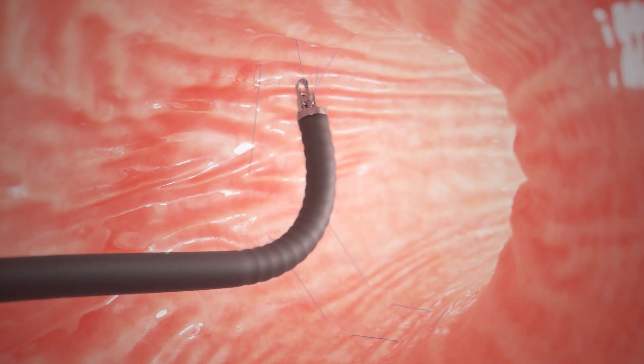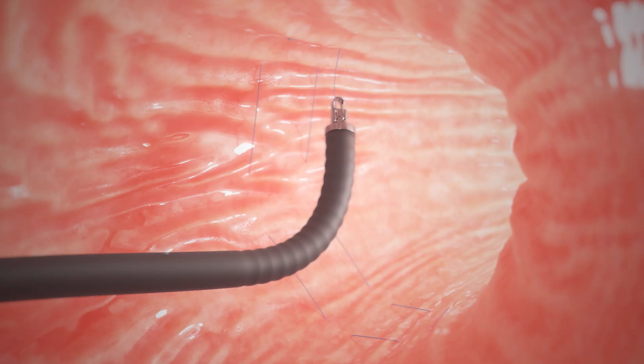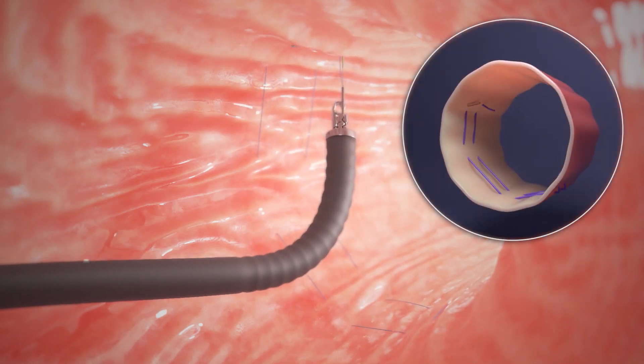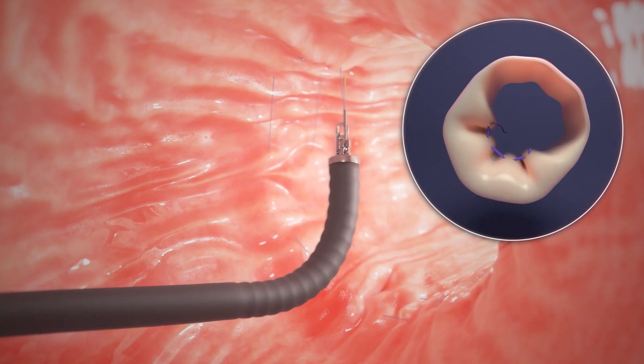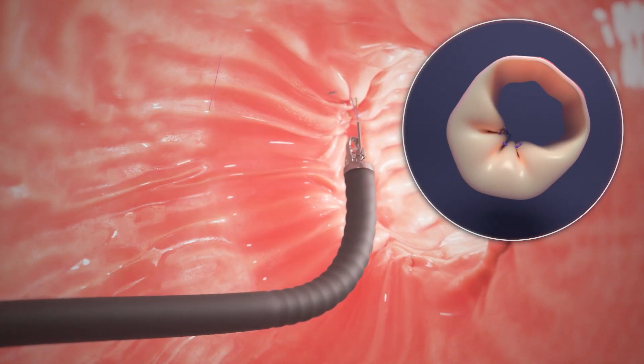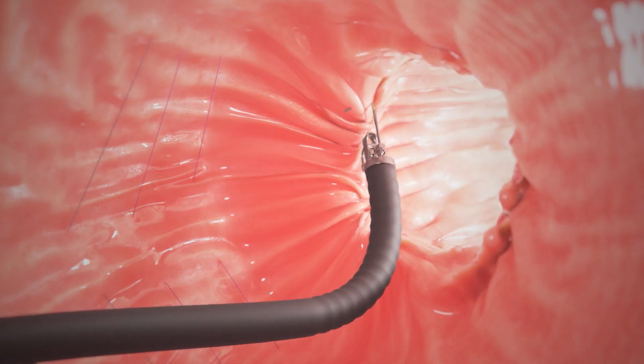As each U is completed, the suture is tightened down to reduce the volume of the stomach. The doctor continues to sew along the large curve of the stomach until six to eight sutures are completed.